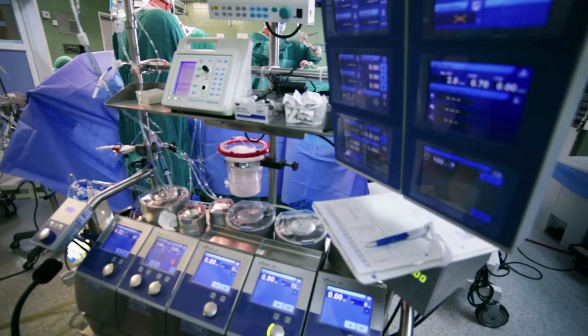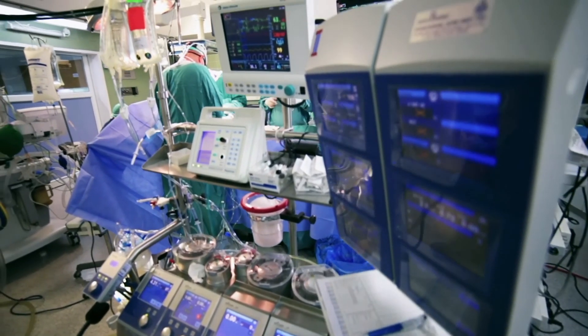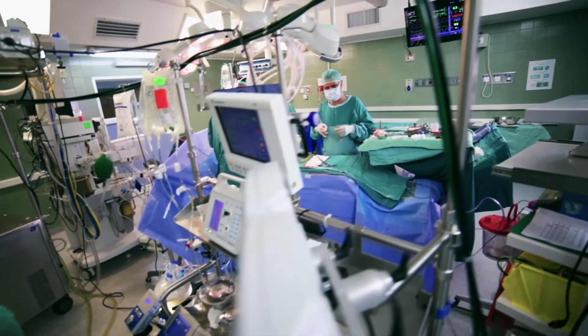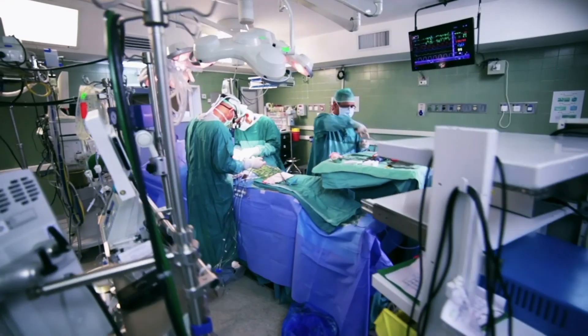When used consistently, PCDs are trusted sterilization monitoring devices that improve the safety and efficiency of device manufacturing personnel while reducing the risk of healthcare-associated infections for patients.